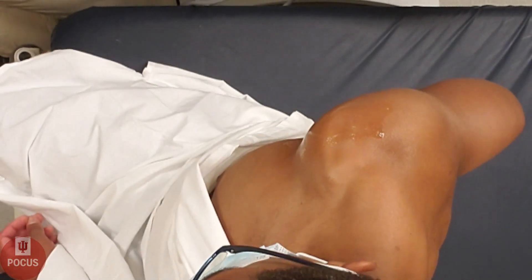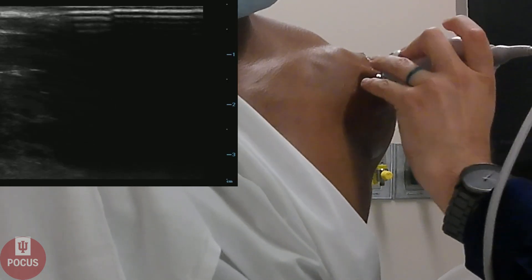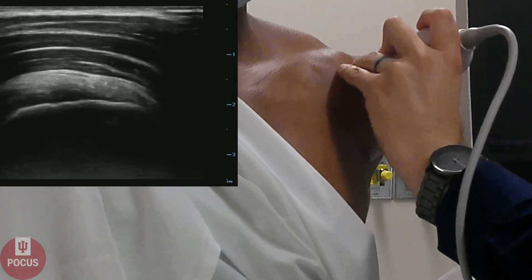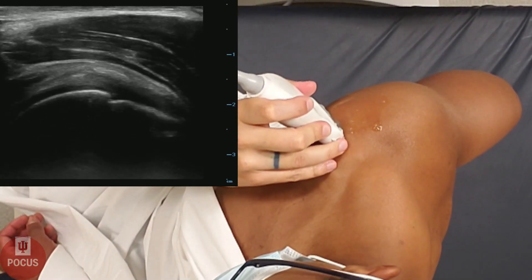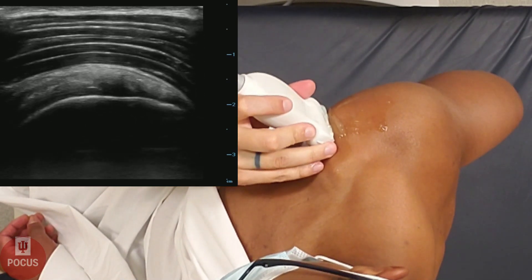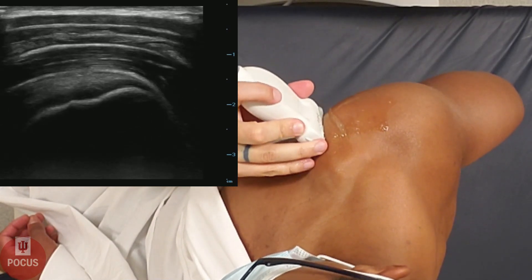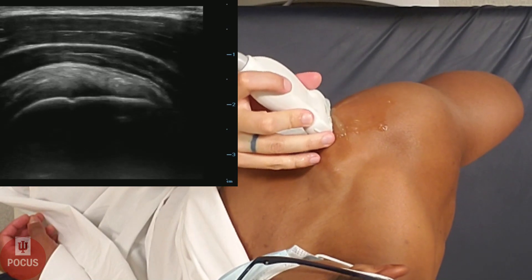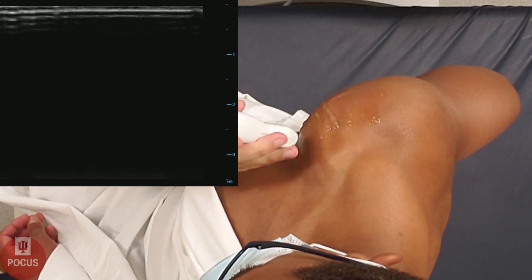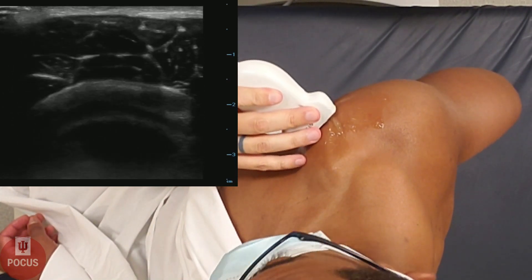Next, we're going to have the patient go in a modified CRAS position, placing his hand on the backside of his hip. This brings the supraspinatus tendon out. The supraspinatus tendon again is going to have that bird's beak appearance in long axis. We're going to start at the acromion and go down just a little bit to get a good full view of the supraspinatus in long axis, looking for any disruptions in the cortex of the bone or any disruptions in the tendon itself. Then we go short axis, again looking for disruptions.